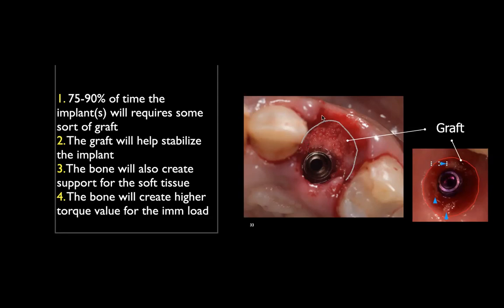So therefore, I'm not only putting it in here for the purpose of the bone graft, because this distance is very, very grave, but also because in case the patient functions on the implant, this bone, and I densely pack this bone. I don't pack it like your regular bone graft that you do when you are extracting your tooth, where you go with a light touch to tighten it firm. But I really pack this very hard, because I want to prevent movement and stabilize this implant.